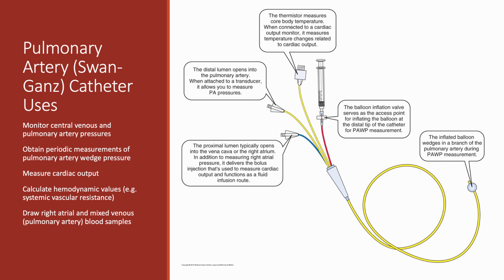Sorry. You probably don't care, but that's okay. So this pulmonary artery catheter is kind of a cool thing. And there's actually a video on YouTube that has a little interview. It's a 1-minute interview with Dr. Swan, and he was talking about his inspiration for developing this, because up until then, pulmonary artery catheters were just long catheters that they put in through the groin and they went into the heart, and then they just kind of had to direct them around, and it was hard to do.